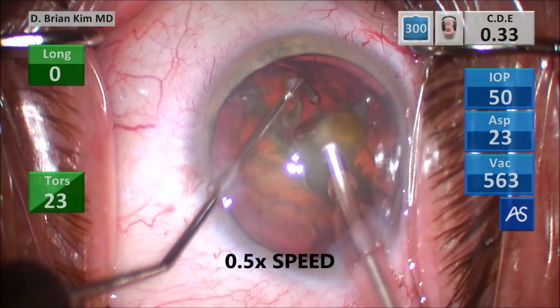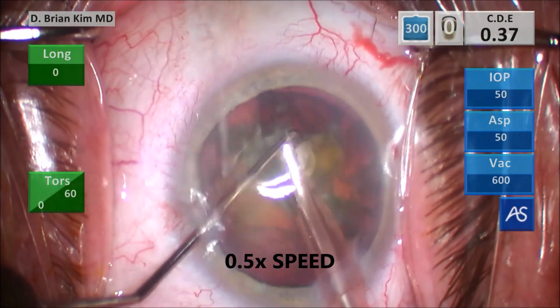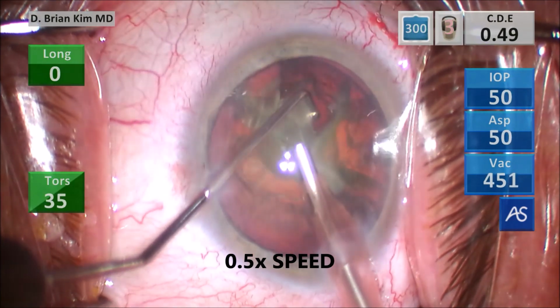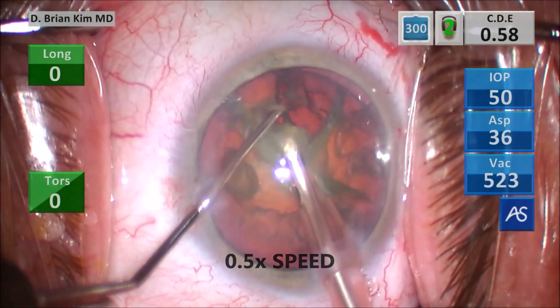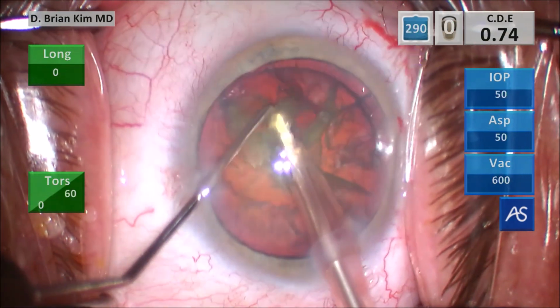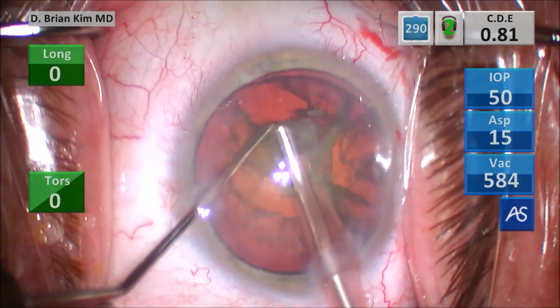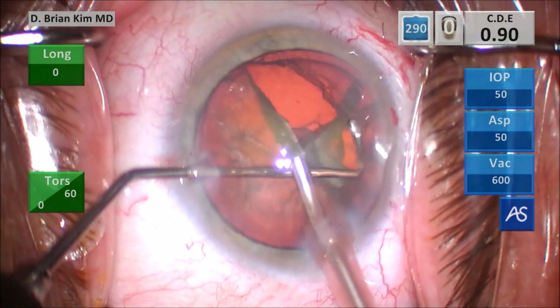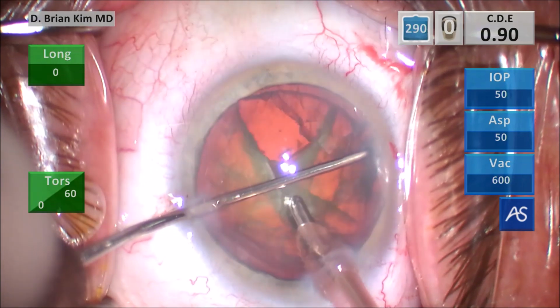And so that's really the most important step, is knowing how to position the instruments so you get maximum crushing force. Now remember, in all the traditional techniques of lens disassembly, you're going after the lens piece from the top. It makes no sense when the thickest part and hardest part is deeper. And so that's why using this technique is just so much more efficient.